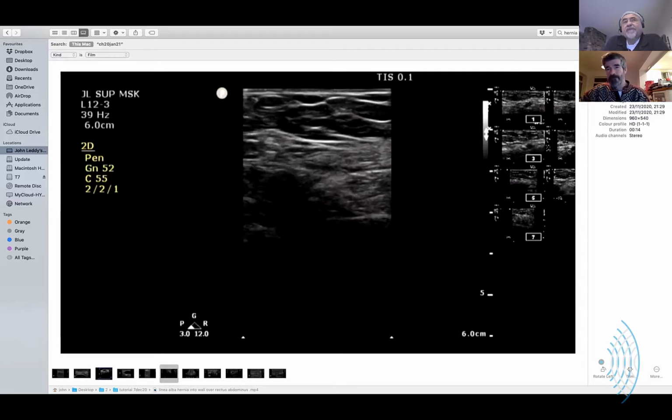And if I were to be certain I have scanned the region, looking at that abdominal fascia below the muscle layers at various angles, under loads, if there were a hernia actively herniating, I should see something that breaks the plane of that white line somehow.